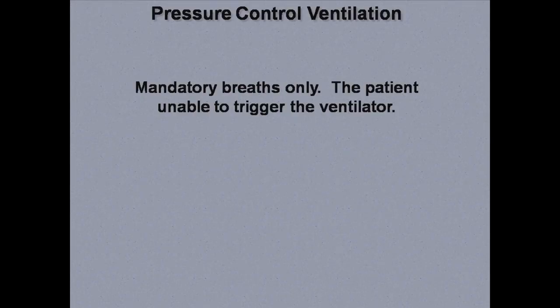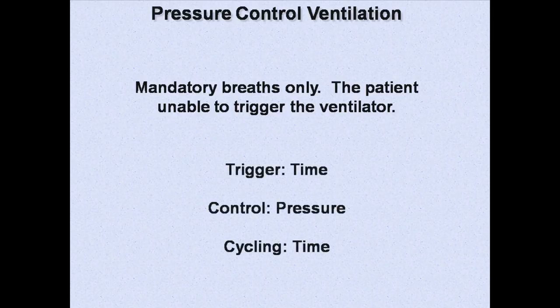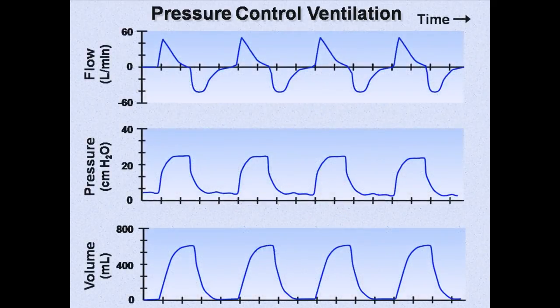The next mode to discuss is pressure control ventilation. This mode has only mandatory breaths in its more common formulation, and the patient is unable to trigger the ventilator. It is time triggered, pressure controlled, and time cycled. Here are the flow, pressure, and the volume tracings.